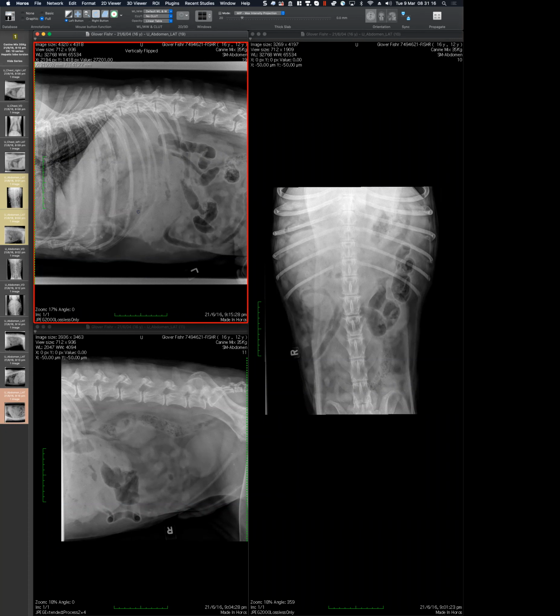But do you quickly push them onto their side and take a lateral, because we can't change the location of the plate? Well, no, and I already have a comment on that. So now we're going to technique. In the early days, when you had the analog, this was a piece of cake, and it was very easy.